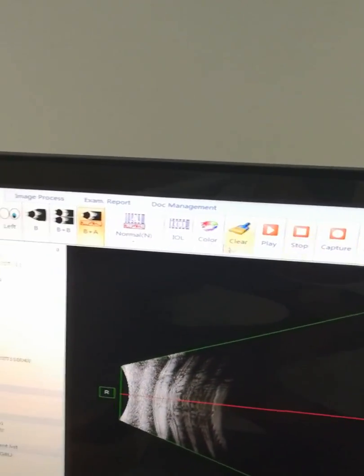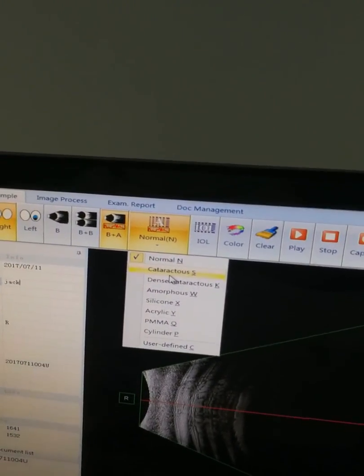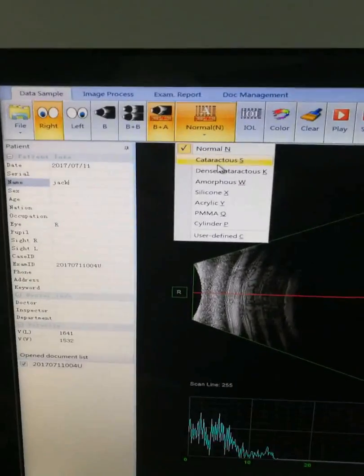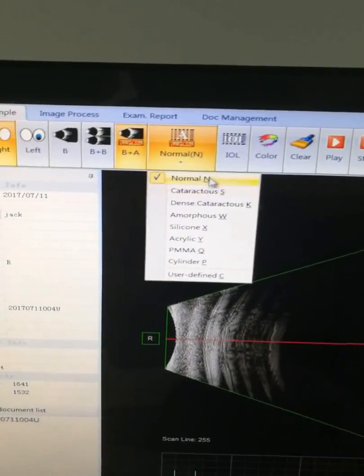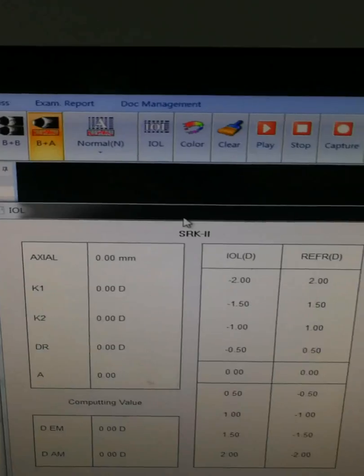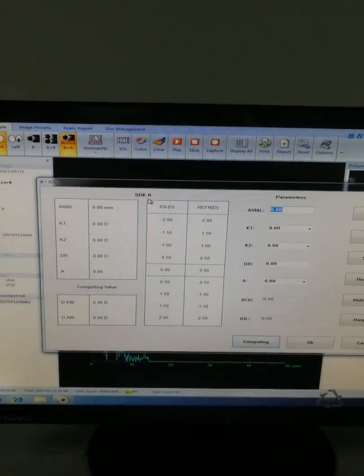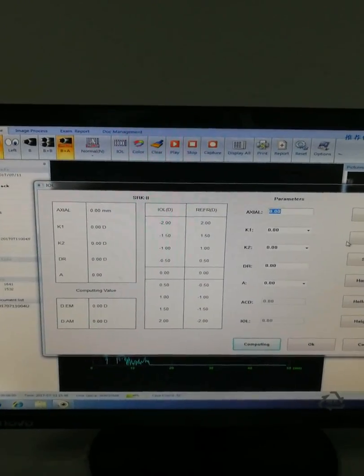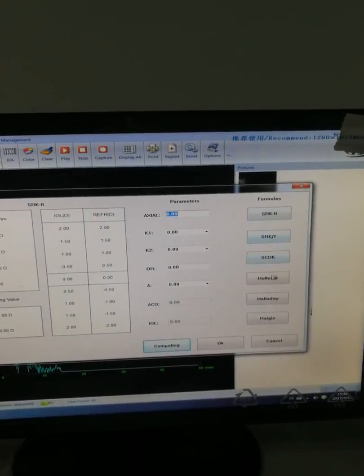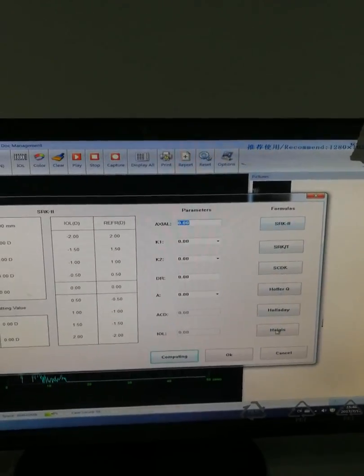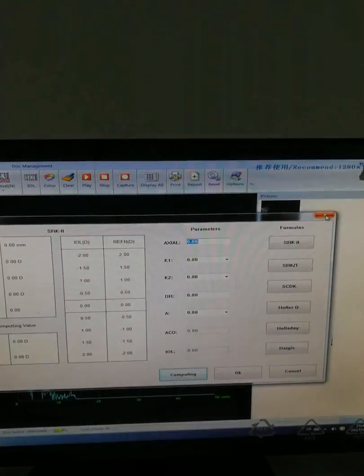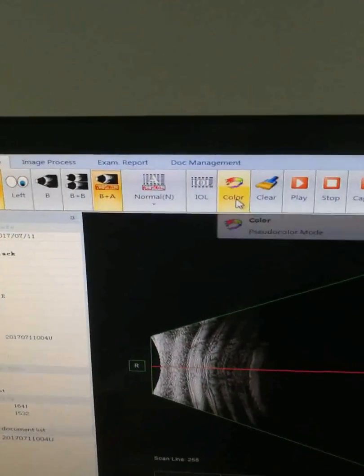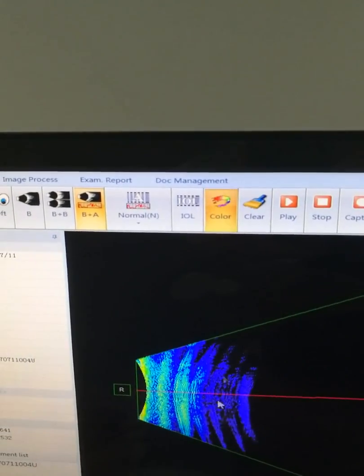You can choose the test item according to the patient. Here is the IOL formula. There are six formulas total; you can choose according to your requirements.